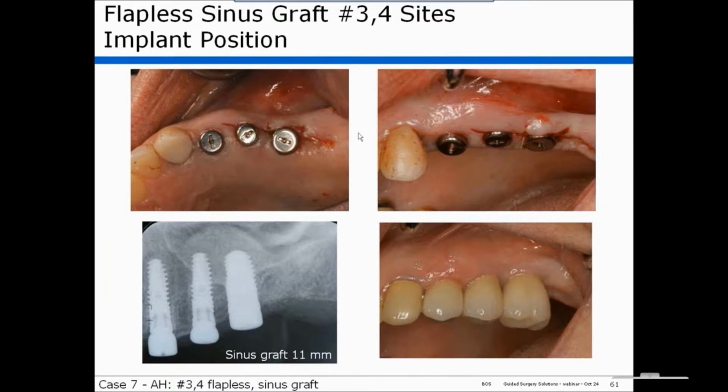Okay. Another question that came in is, essentially the dentist is receiving 2 surgical guides when they order surgical templates. Is that correct? Yes. Each case we provide a tube guide and a thin layer guide. Okay. I think we could proceed.